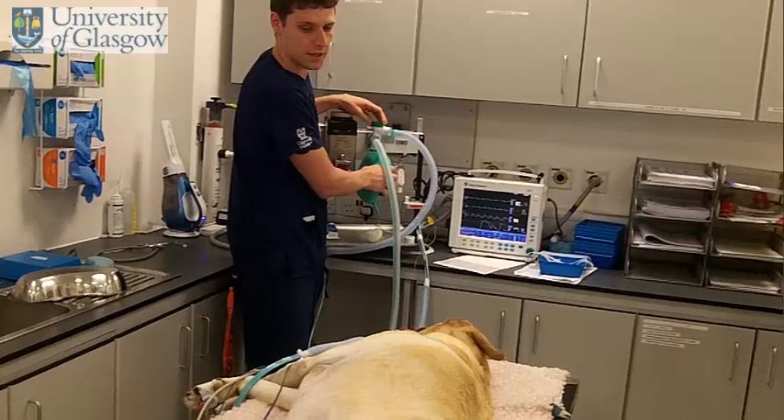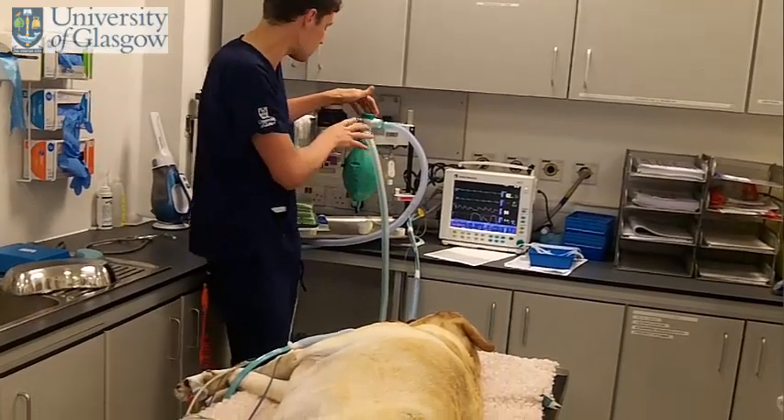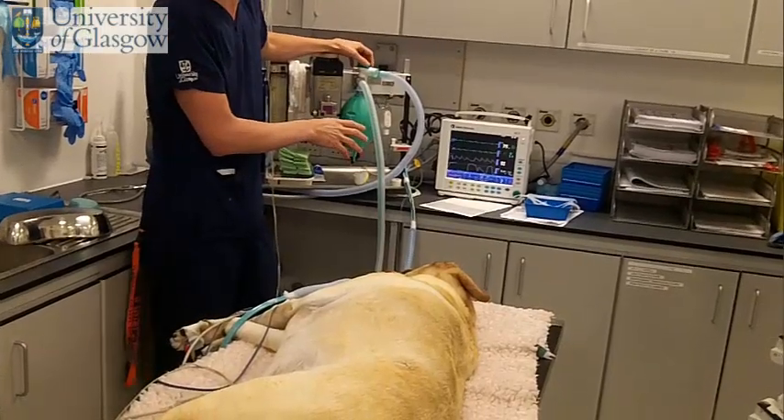What we have here is a dog that needs to be ventilated because she's not breathing very well. So we're doing IPPV on a Bain breathing system.